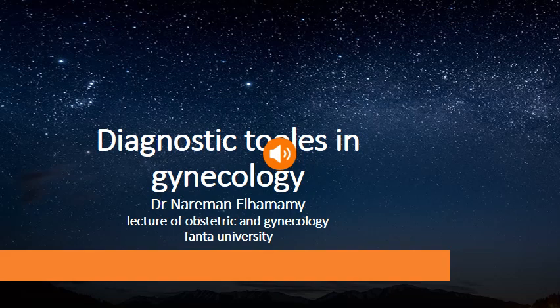but I still have my reservation about the CT. It's less accurate in ovarian masses. The most accurate in ovarian masses, especially when it's full of fluids or full of blood, is the ultrasound. So ultrasound, then laparoscopy, then hysteroscopy, then colposcopy. These are the most golden tools in the diagnosis of gynecology.